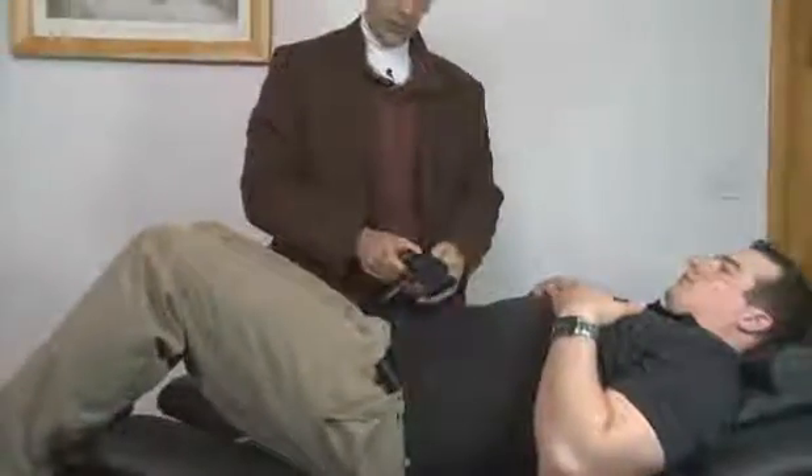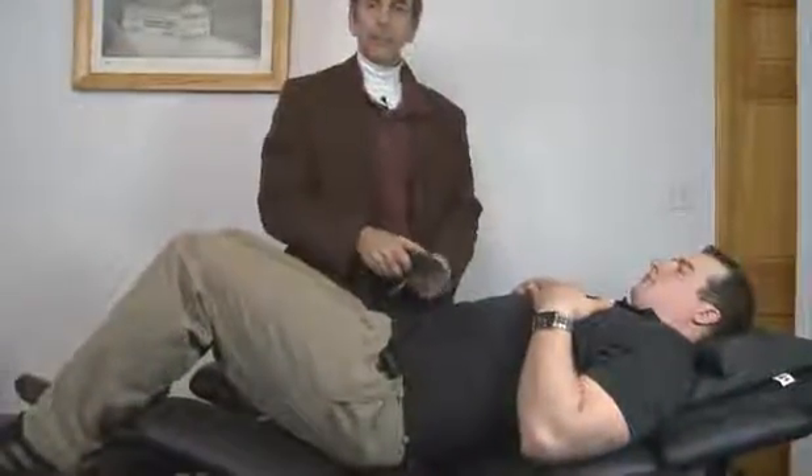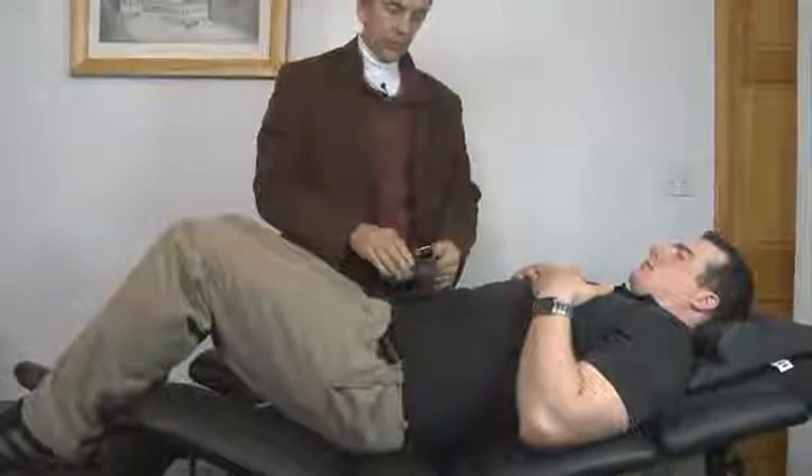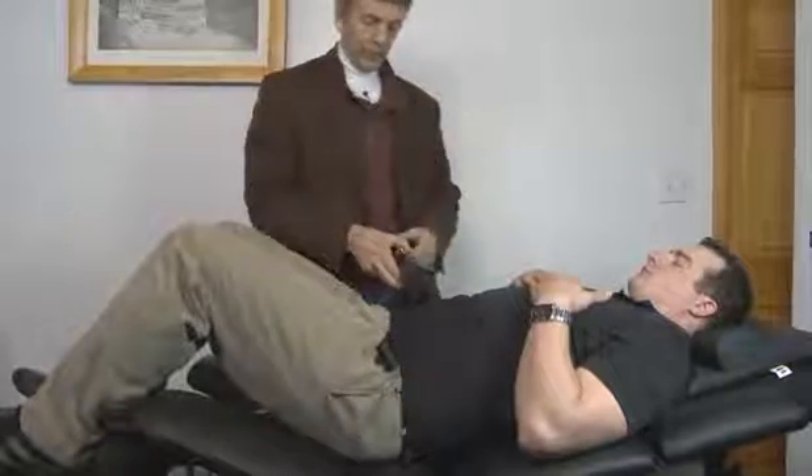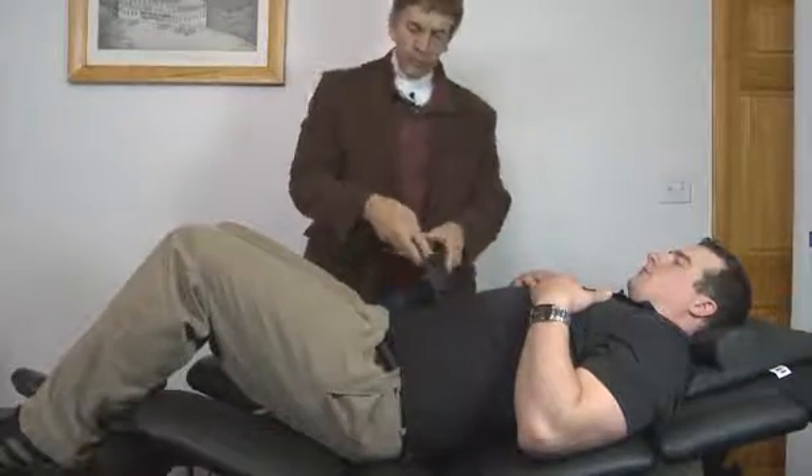So if a CA or the doctor is having difficulty getting the belt tight, this can be the solution. It can be used in both the supine and the prone position.